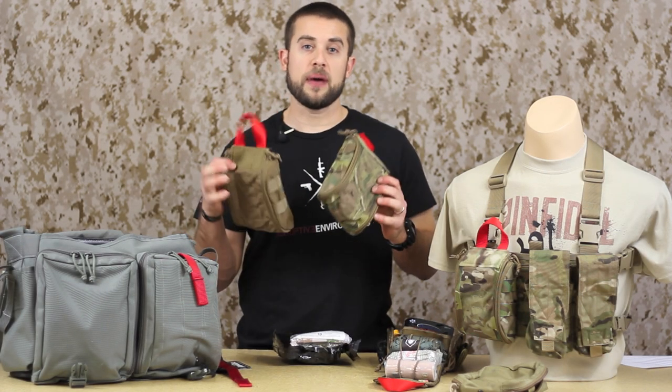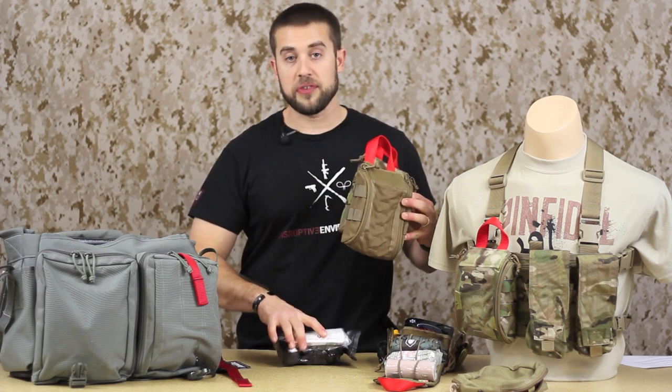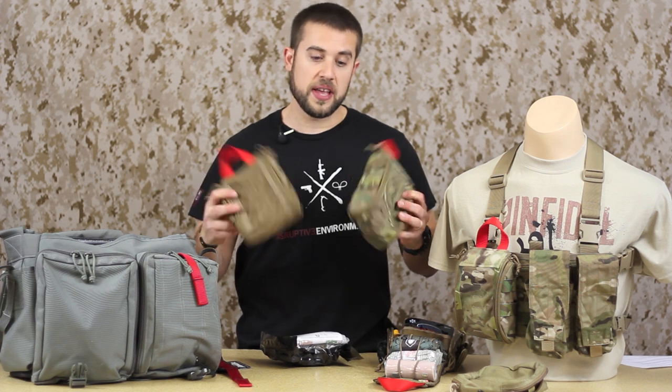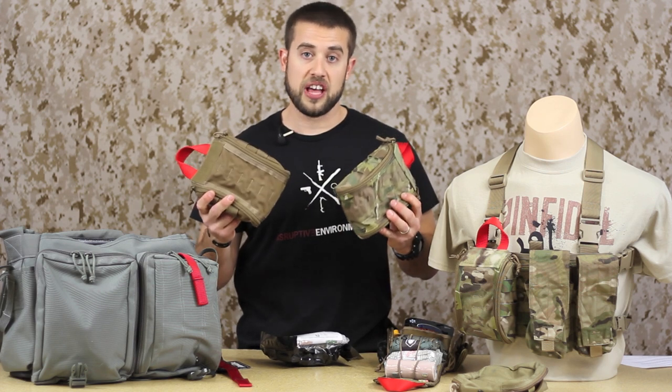Hey guys, welcome to ITS Tactical. Today we're going to be taking a look at our brand new trauma kit pouch designed exclusively by Zulu Nylon Gear to hold our ETA kits. So let's take a look at this — we'll zoom in and I'll show you all the features and functionality of the brand new pouch.